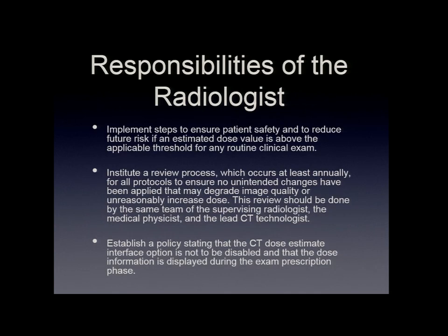The radiologist also is charged with overseeing that patient safety is accounted for in the whole process, that they're reducing the risk from the dose from getting this study. And so they want to make sure that they're constantly involved in this. Therefore they need to establish some type of review process. Some people call it the CT Dose Monitoring Committee, or just General Dose Monitoring Committee if it includes other modalities.